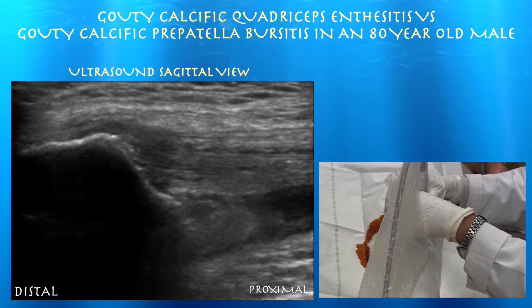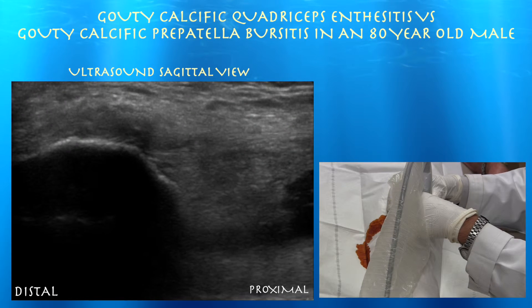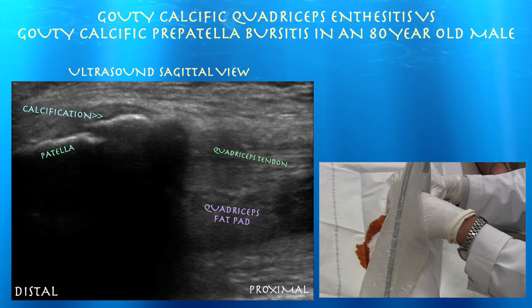You can see the quad tendon inserting on the patella, which is on the left, and you can see all this calcification in the distal quad tendon. I believe it's a gouty type of enthesitis — he has a history of gout. We previously aspirated his olecranon; he had a gouty olecranon bursitis. I believe something similar is going on, probably in the pre-patellar bursa slash insertion of the quad tendon. My plan is to break up that calcium with a needle, inject it with some saline, and then inject some cortisone around it.